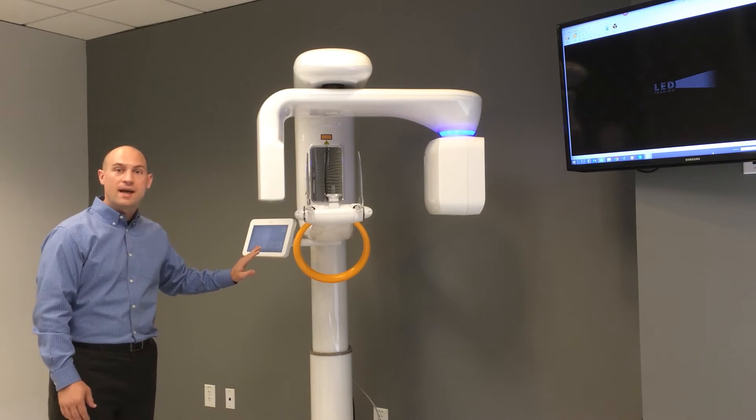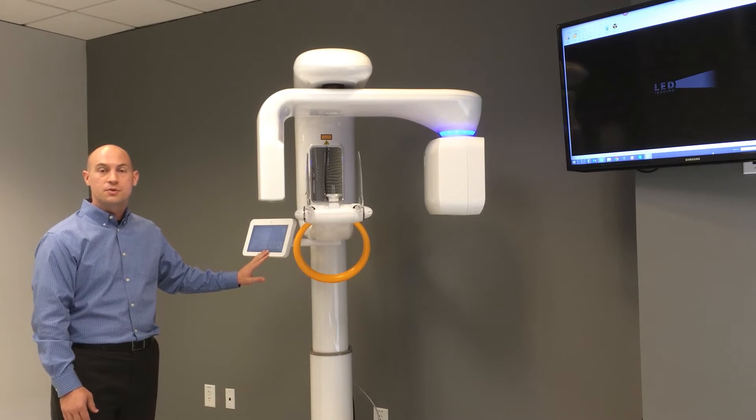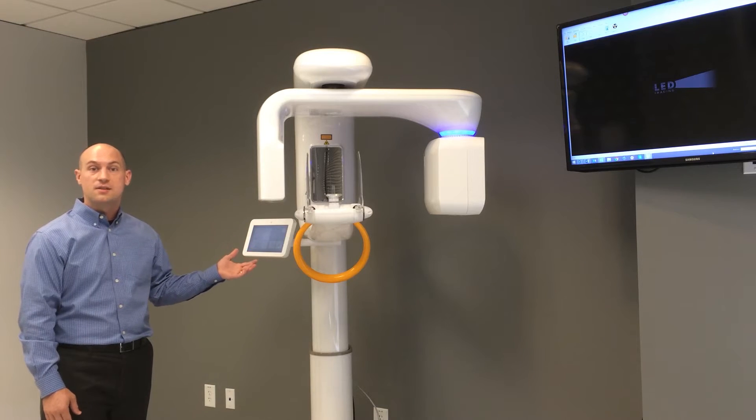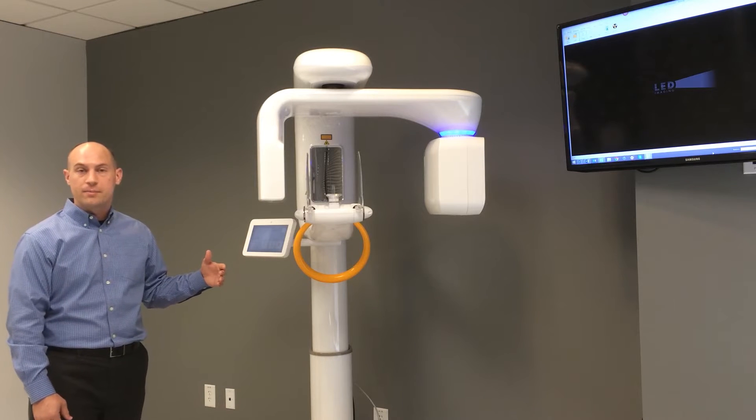Around the left side here we have our touchscreen, which will mimic a lot of what we'll see on the computer screen as well. It gives us the option to choose different protocols or patient sizes, move the machine up and down, turn our lasers on, or get the machine into a ready mode.